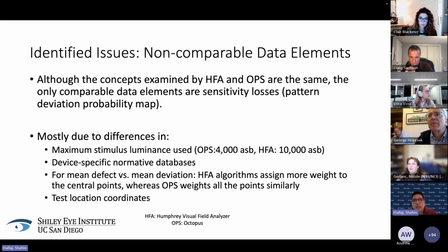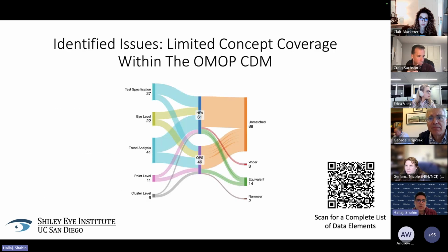Another issue that we had was the non-comparable data elements, meaning that because of the differences in the testing algorithms and differences in how those stimuli are being represented, the same concepts measured by different vendors are not necessarily comparable with each other. So we had to have a way to differentiate what device was used for the test.